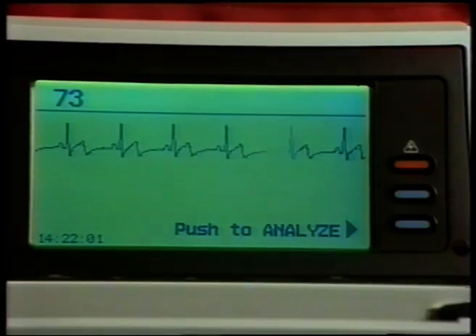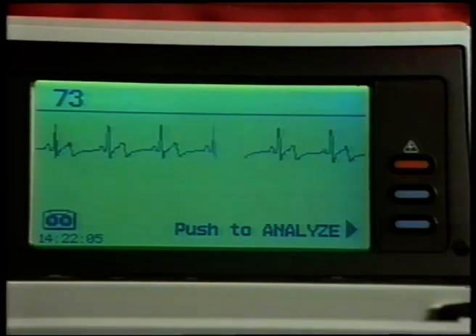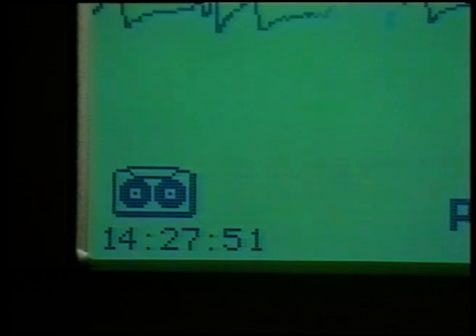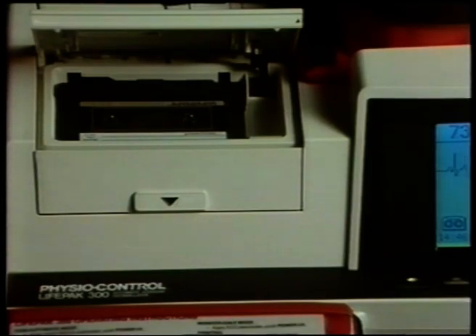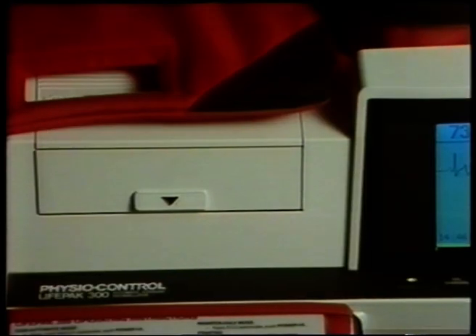A closed tape door display message flashes continuously if the tape door is open or ajar. If this message is displayed while the unit is in service, it will not affect operation of the device. However, the tape door should be closed immediately to protect the tape deck and the interior of the device from the environment.